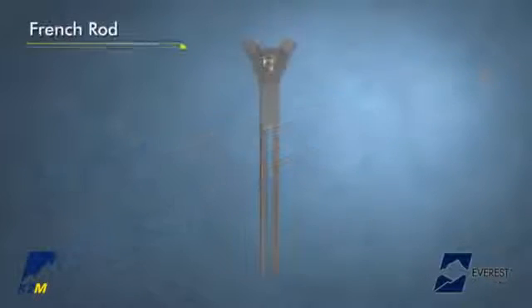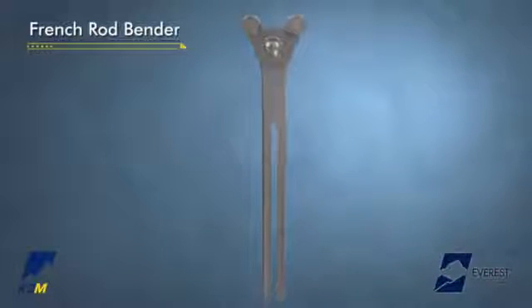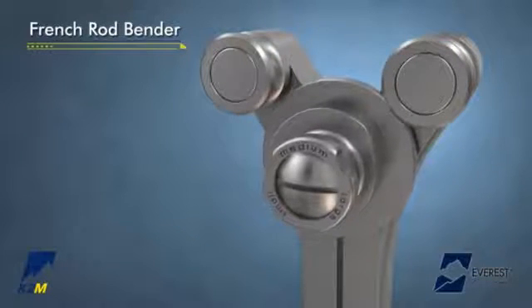A French rod bender may be used to contour the rods to the desired amount of lordosis or kyphosis. The rod may be bent to the desired curvature — small, medium, or large — by pulling out and rotating the dial.